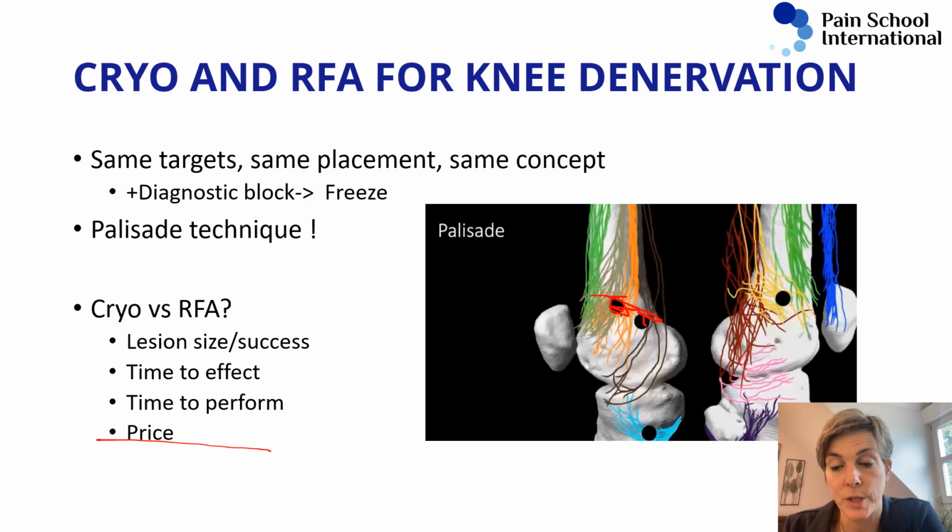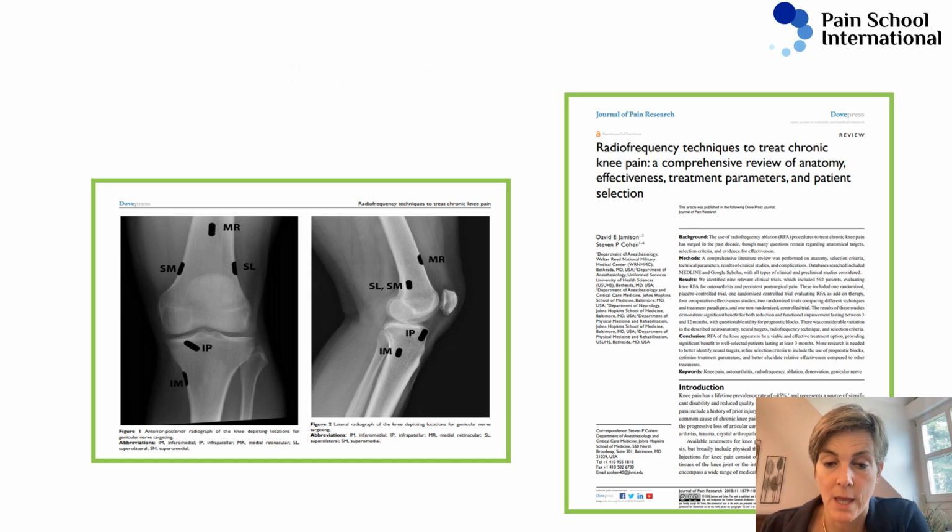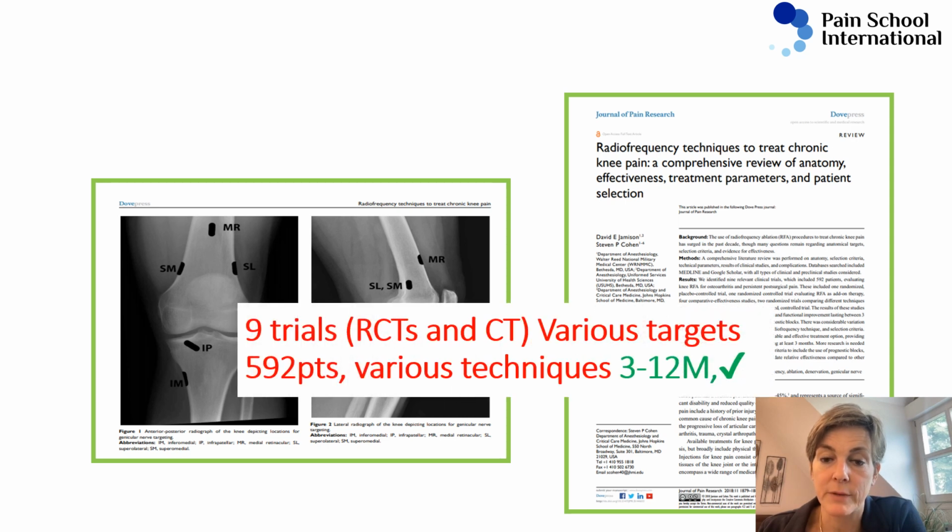Radiofrequency is cheaper than cryoablation. And also we need to consider, of course, the available evidence. Now this is an easy summary. We have lots of randomized controlled trials for radiofrequency, but we do not have RCTs for cryo for this indication.